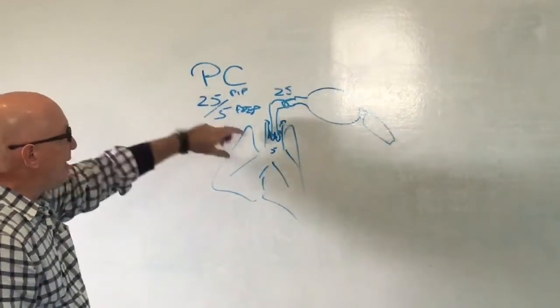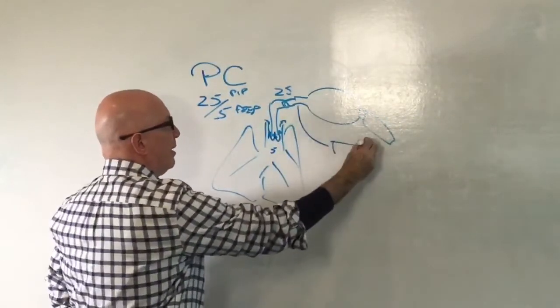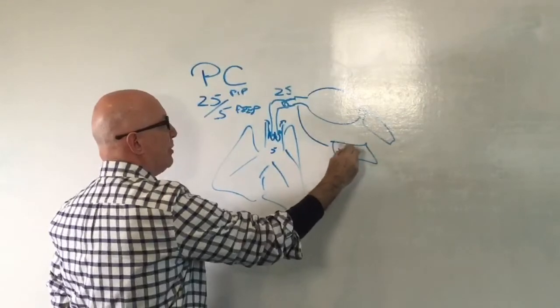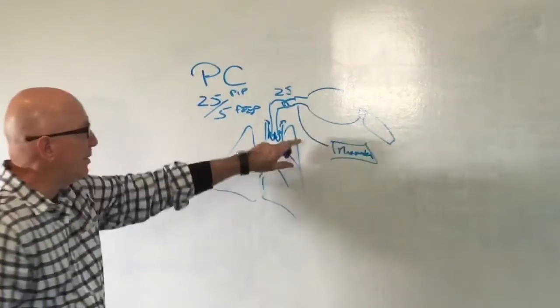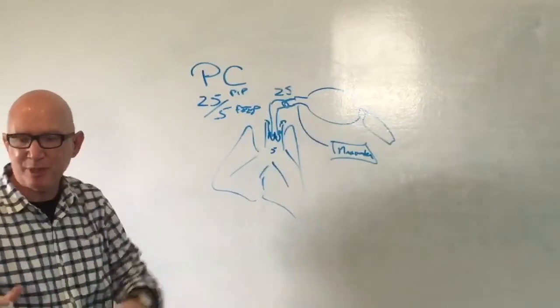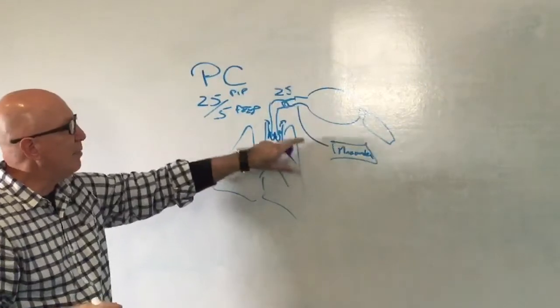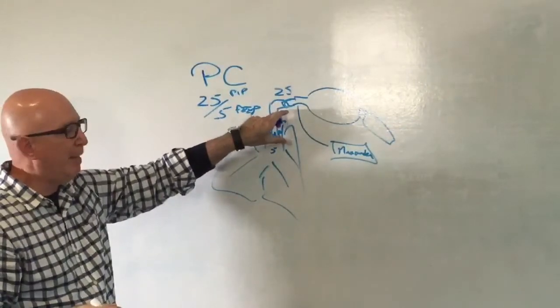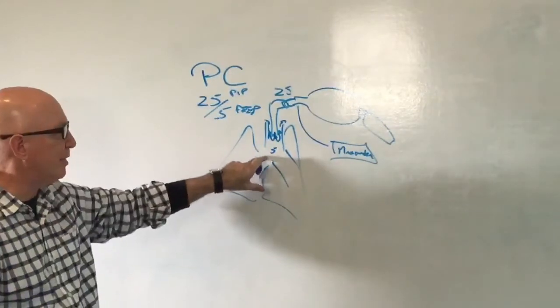So what essentially he was saying was, because at that time in our NICU, we used to hook our resus bags up to a manometer, an electronic manometer. So this transducer was measuring pressure. So the pressures we generated with the bag were the same pressures that we were generating with the ventilator. And so the physician was saying, why when I generate pressures with the bag that are the same as the ventilator, I can get the chest to rise, but I can't get it to rise when I ventilate them with the ventilator.